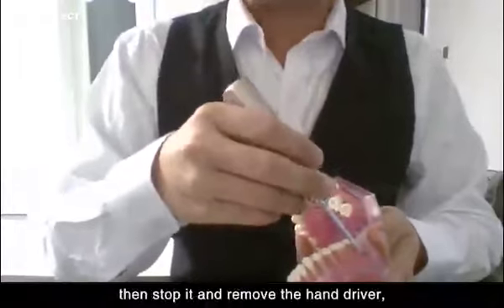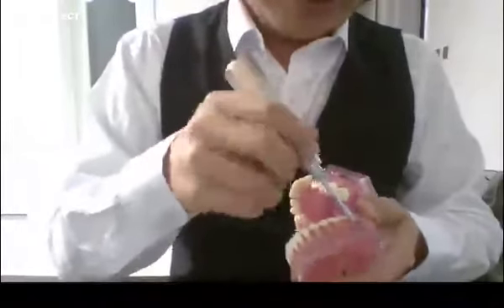Then stop it and remove the hand driver. It's finished.